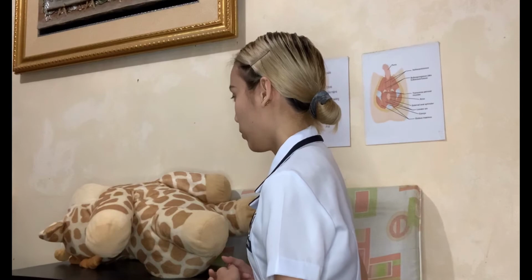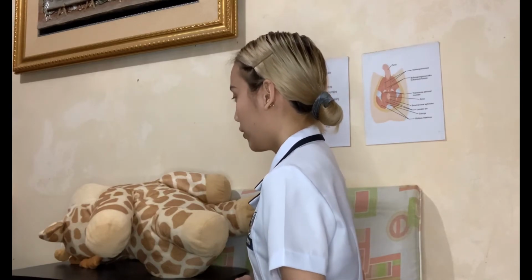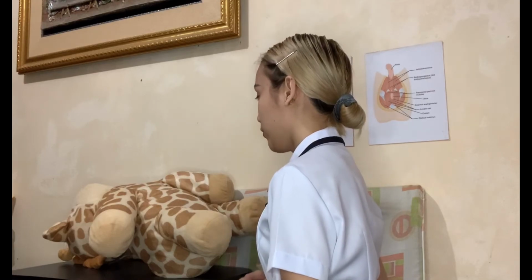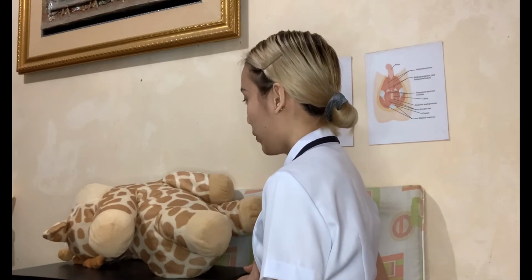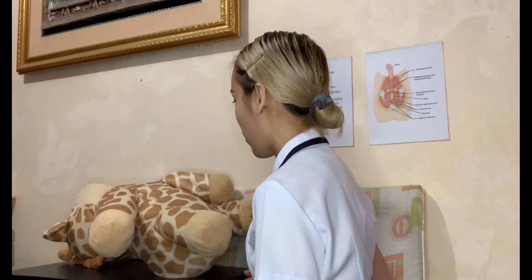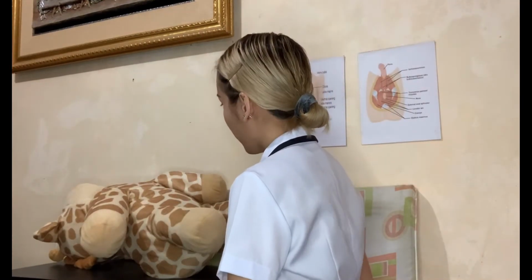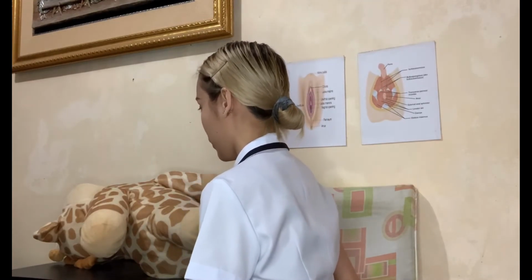Good day po, ma'am. I am your nurse for today, Nurse Anzhela Eryn Ataiza. For client identity verification, you are Mrs. Angel Garcia po. Am I correct? Yes po, nurse. So today po, I will be performing urinary catheterization.